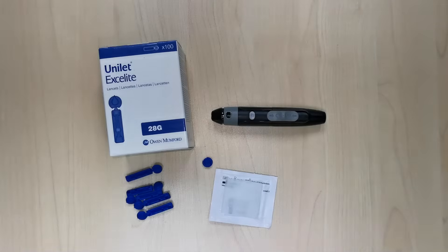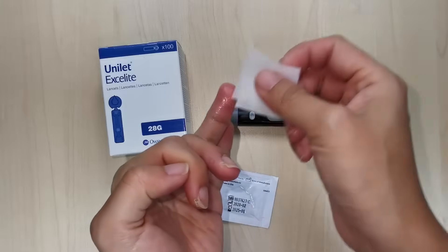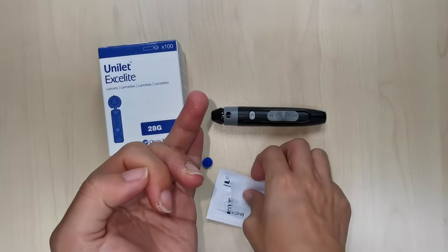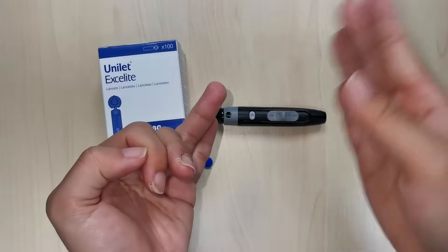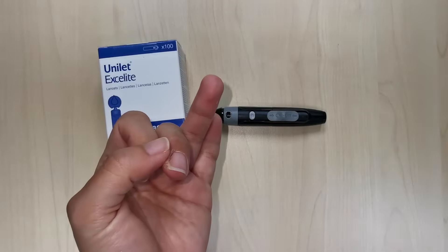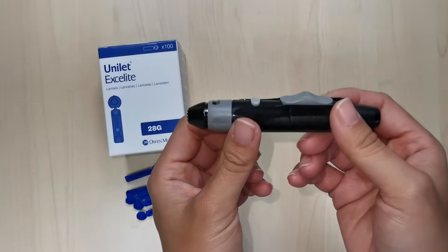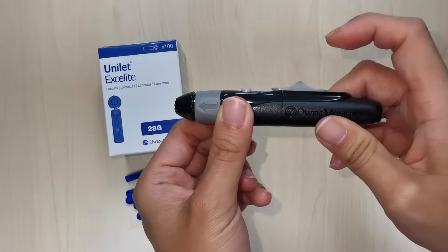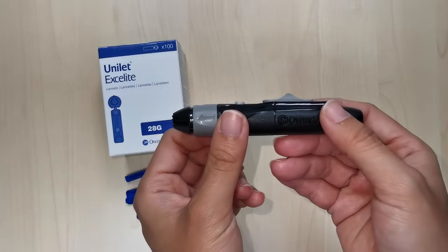How to prick fingertips with a lancing device and lancet for checking blood glucose. To get started, you should wash your hands or clean your fingers with an alcohol swab and allow it to air dry — this is to avoid contaminating your blood drop. Also, do not wipe your fingers dry. Make sure the lancing device is primed by pulling the slider; the Autolet Plus automatically primes when you insert the lancet.